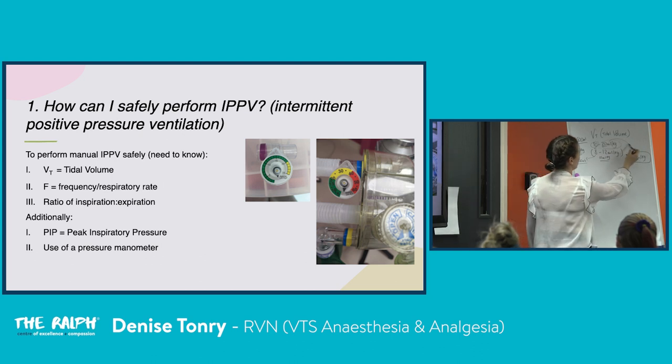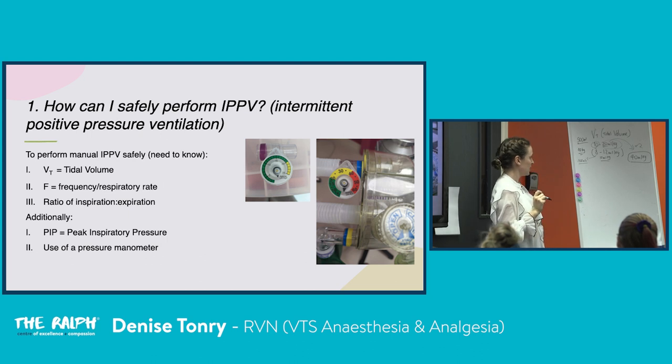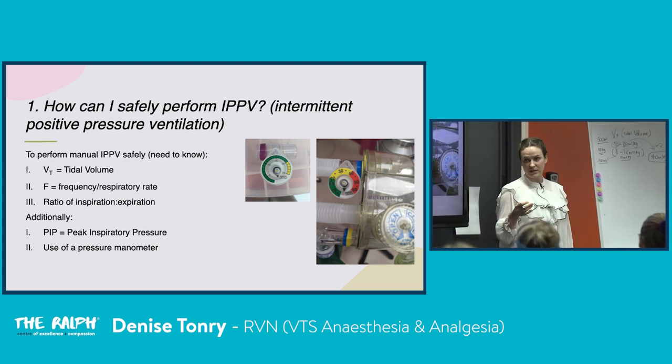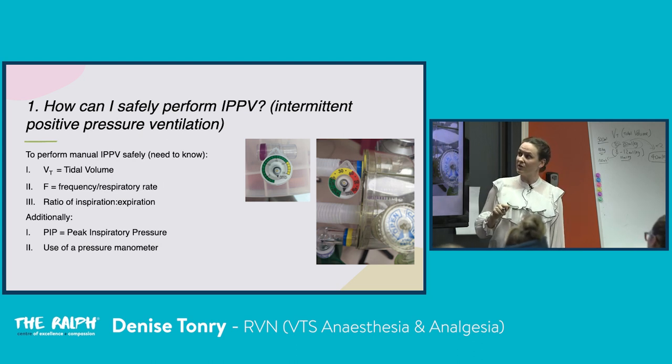You can see this is twice the max tidal volume that we would use for patients. When I started doing this calculation, I realized I was just grabbing 3 liter bags for 20 kilo Labradors and they don't need it. Their lungs are not that big. That means when we provide IPPV, we're more likely to provide safer volumes and safer pressures using smaller bags. It's just math, because we'll squeeze the bag and we'll have an estimate in our head.